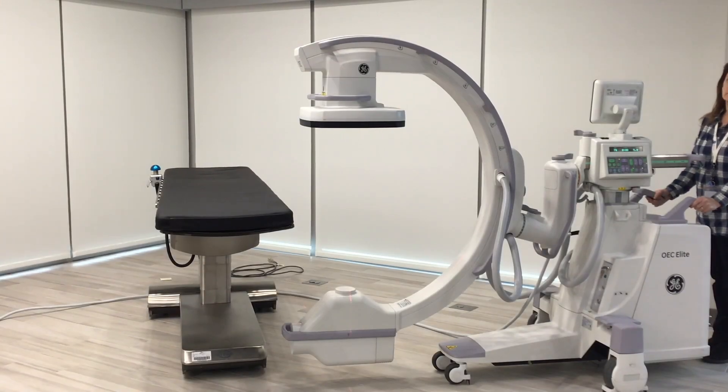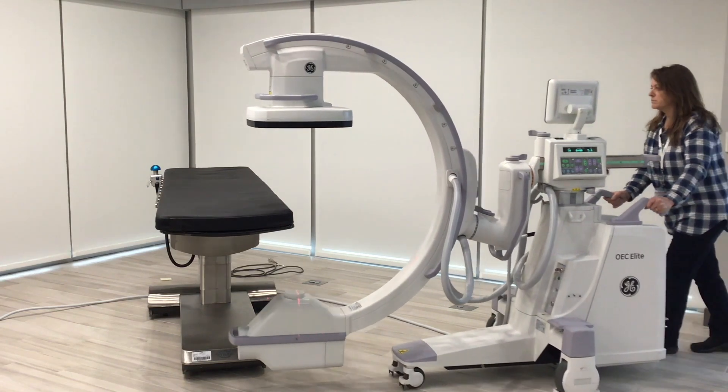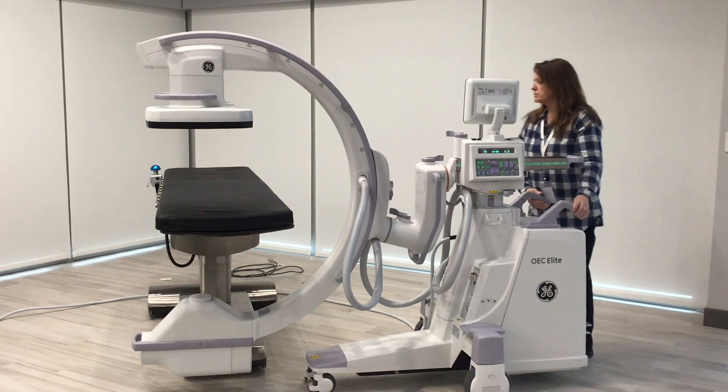So typically you see we have an OR table here and the C-arm. If you imagine a patient positioned on the table in the supine position, the doctor asks you to bring the C-arm in over the top of the patient. You pull the C-arm in and sort of eyeball where you think you're positioned.